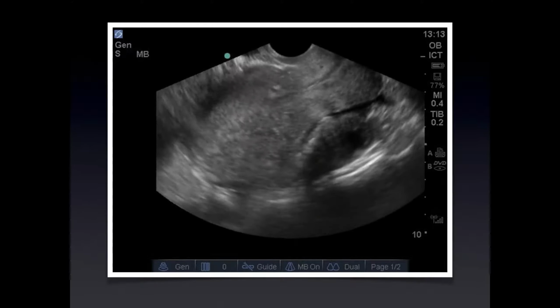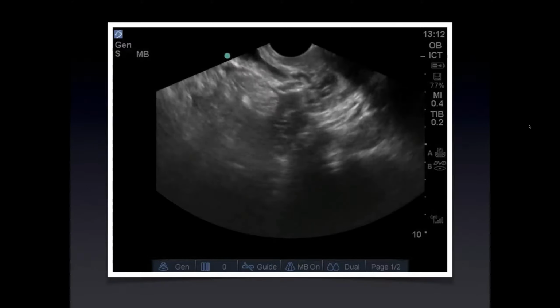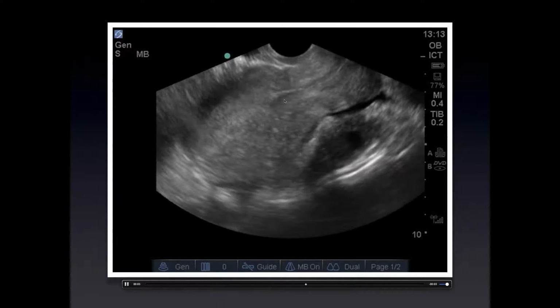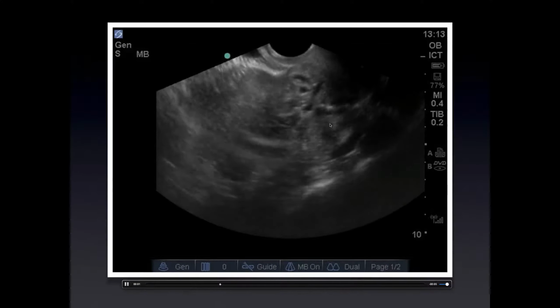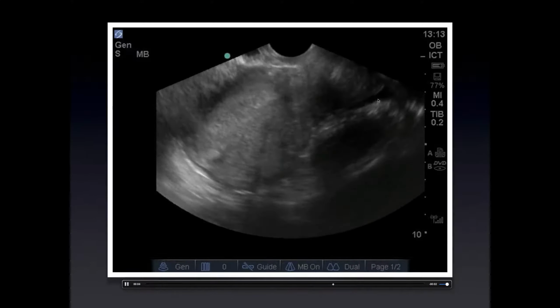We're once again performing an endovaginal ultrasound. I hope you saw the uterus coming in and out of view here already. Here's the cervix connecting to the fundus. We do not see anything definitively within the uterus here. So far I would call this an ND-IUP. Let's look outside the uterus to further stratify. There's a little bit of free fluid back here. And there's a mass-looking structure there. Let's get a closer look at that.